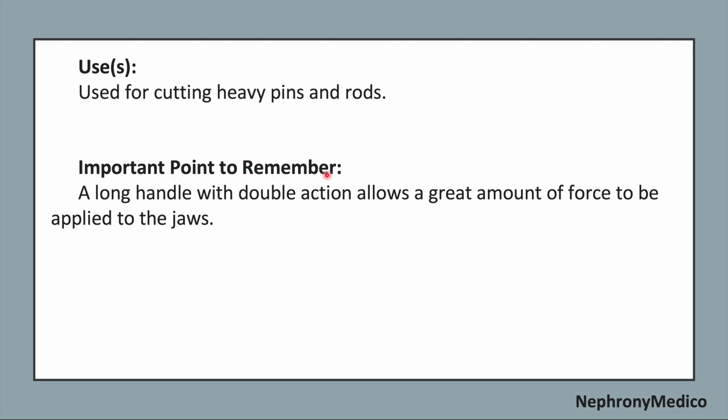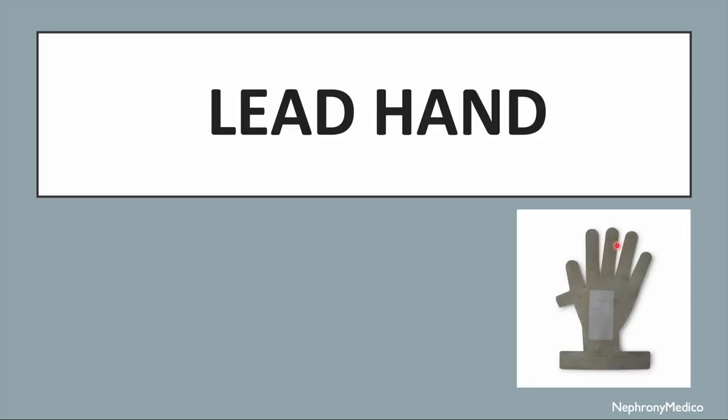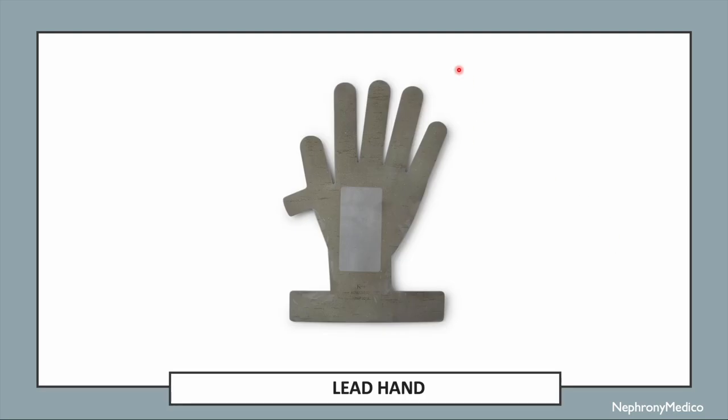Important point to remember while using this instrument. A long handle with double action allows a greater amount of force to be applied to the jaws. Let's talk about lead hand. This is a picture showing a lead hand.